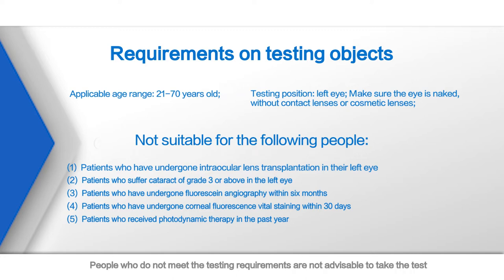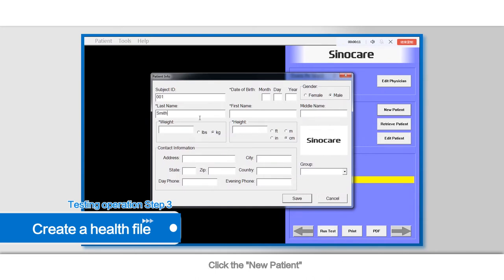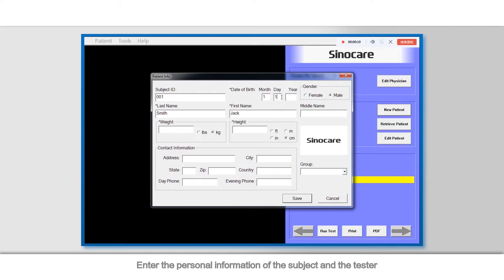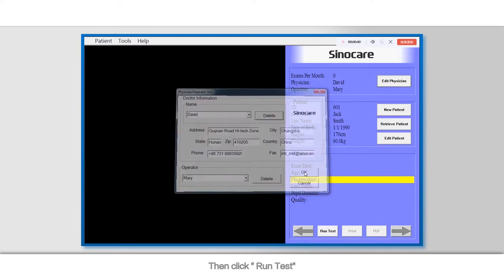People who do not meet the testing requirements are not advisable to take the test. Testing Operation Step 3: Create a health file. Click New Patient, enter the personal information of the subject and the tester. After confirming the above information, click Save, then click Run Test.